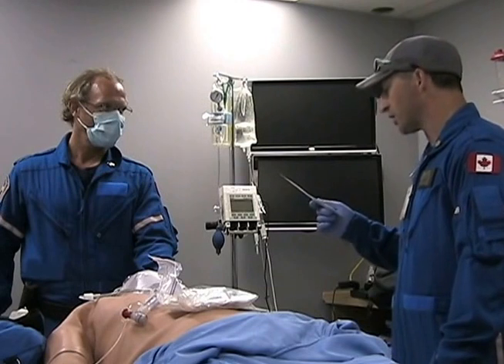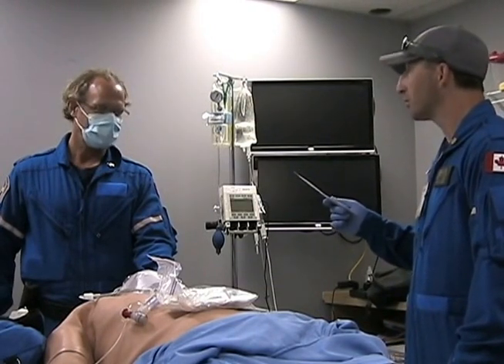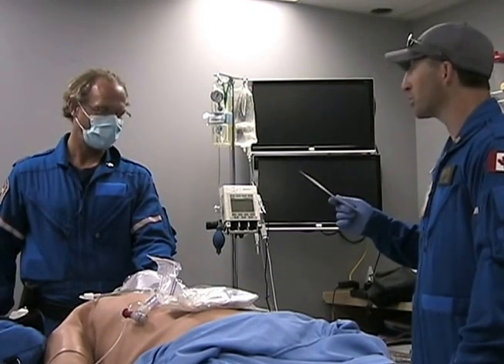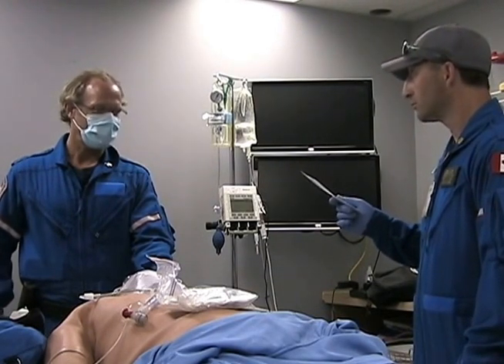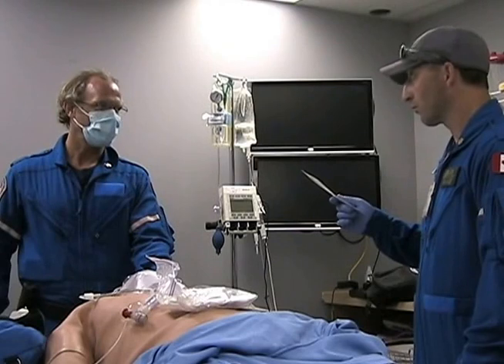Assign someone to call out saturation thresholds for SpO2. Okay, if you're able to do that, that would be great. Okay, and what's your threshold for SpO2? So as soon as we get down to 92, 93%, because he's 99 right now, we're going to stop our attempt, bag him back up, and then reattempt.